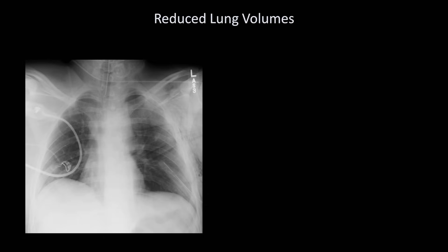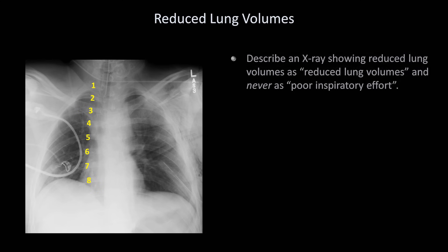The first topic in this video will be a brief discussion of lung volumes. Here is an x-ray showing an example of reduced lung volumes. We know this because when we count ribs, there are only seven full posterior ribs seen above the diaphragm, where normally there should be nine to ten. When describing an x-ray with reduced lung volumes, it is important to describe it specifically as such, and never as 'poor inspiratory effort,' which is frequently done.